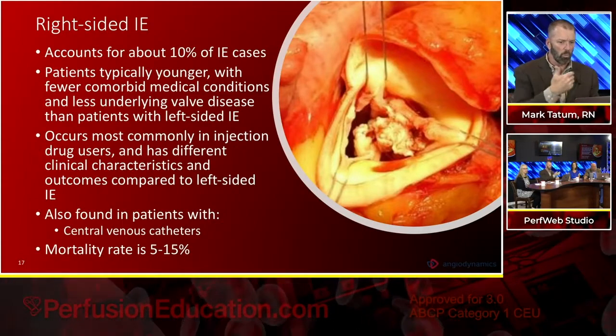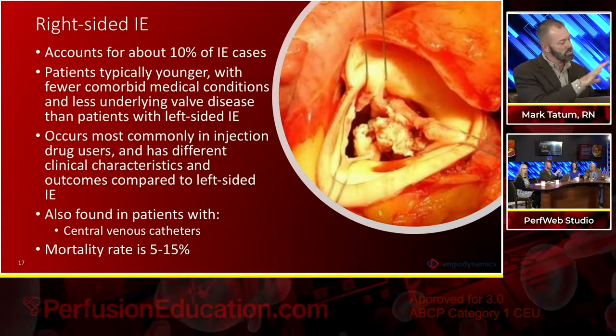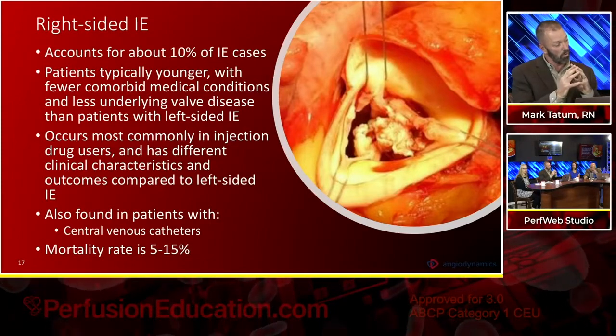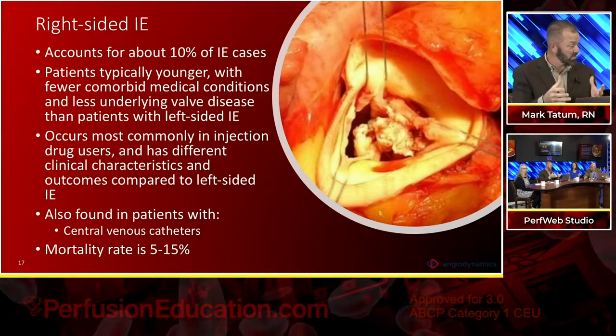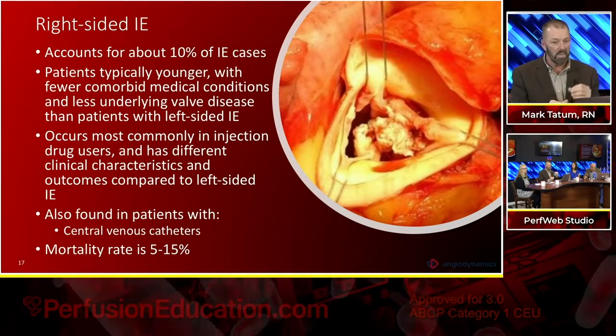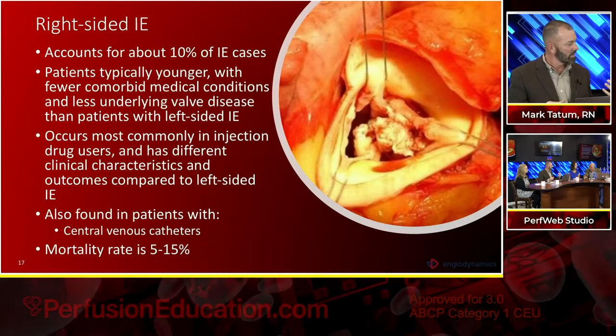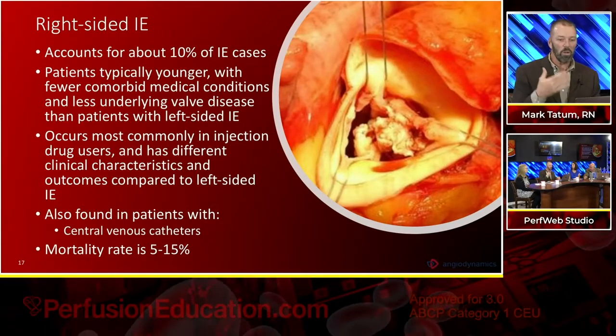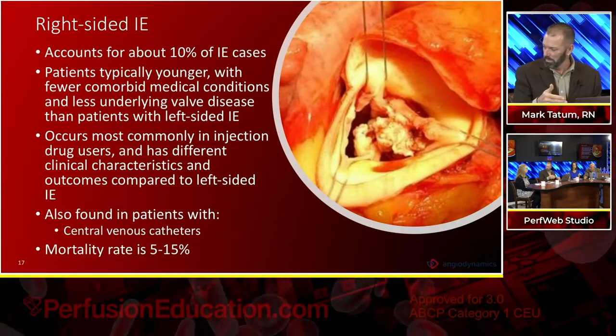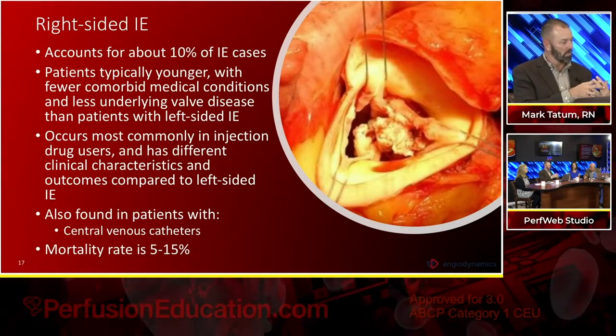So what we see with AngioVac is that in addition to having this growth, you also have a film on the outside called a biofilm, and that biofilm serves as a protection from the antibiotics that are going by. Not to mention the leaflet isn't highly vascular. Exactly. So if we can debulk, disrupt the biofilm, take a large portion of that out, we see a couple of things.